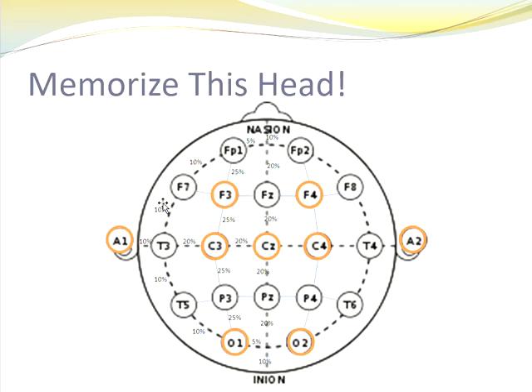If you were to go around the circumference and count up the segments, we'll start here, 1, 2, 3, 4, 5, 6, 7, 8, 9, 10 segments. So 10 parts of 100 is 10. So each component is worth 10%. When you separate these, each segment is equally spaced, so they're all worth 20%, or 25%, sorry.